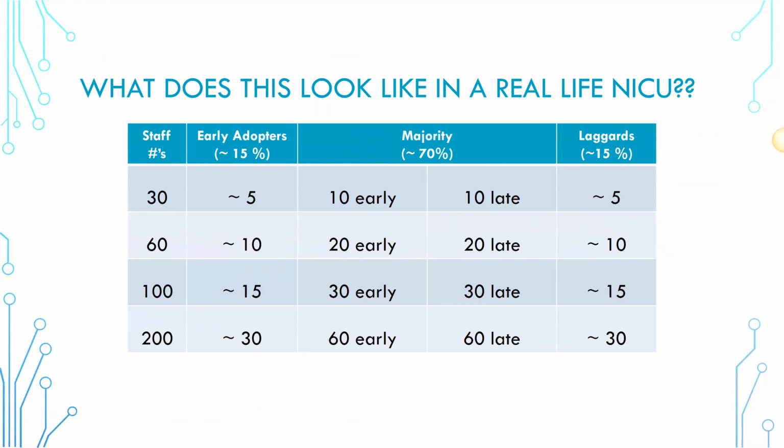And then there are multimodal devices, and there are several of these actually on the market now, and these take not only the amplifier for your EEG and transform it into your aEEG, but they can also display, not necessarily monitor, although some do, other parameters. So they maybe have your heart rate monitor and your aEEG all together.